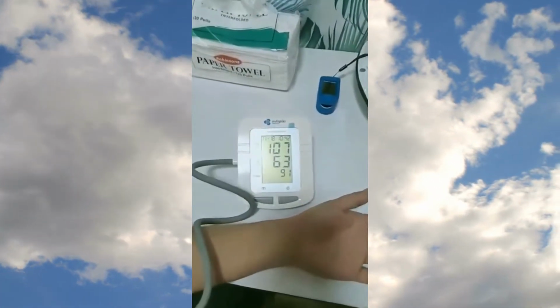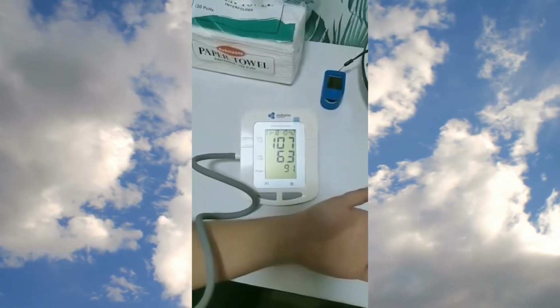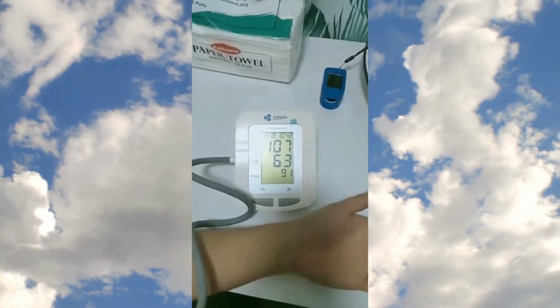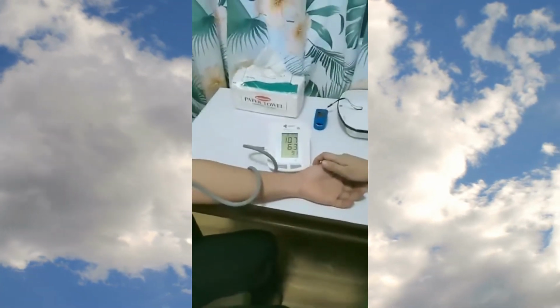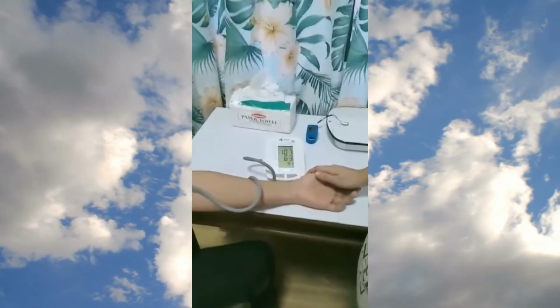And there, you have the BP reading of 107/63 with a pulse rate of 91. So that's how you are going to use this BP apparatus that gives you the blood pressure and the pulse rate or the heart rate.